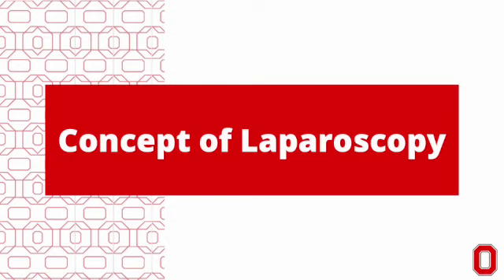Laparoscopy is a minimally invasive surgical technique that was introduced in the early 1900s to reduce complications of traditional open surgery. It is often called keyhole surgery due to the small incisions made. Interestingly, laparoscopy was first used to observe the abdominal cavity of a pregnant woman. And since its advent, laparoscopes and laparoscopic instruments have evolved drastically. However, the fundamental concept of laparoscopy has remained unchanged: to provide patients with a less invasive surgical approach to minimize operative complications and improve patient outcomes.